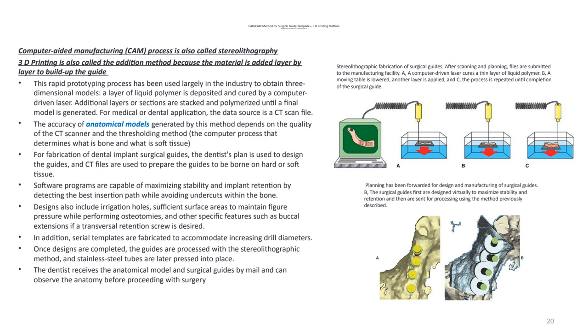This is a very crucial step forward, because during this process, we design and choose the implant selection, the size of the implant, and the position of the implant in the bone, and we design the stent. Before we go into production, before we manufacture the stent, the design has to be approved by the clinician.